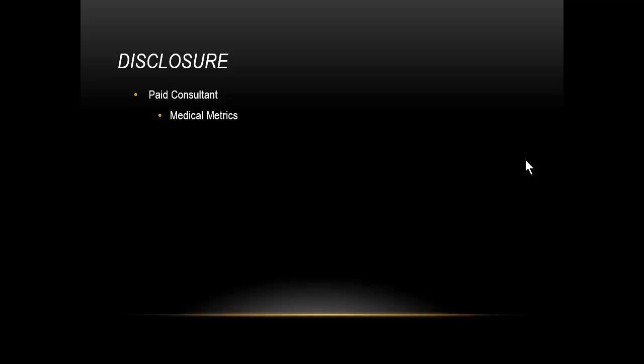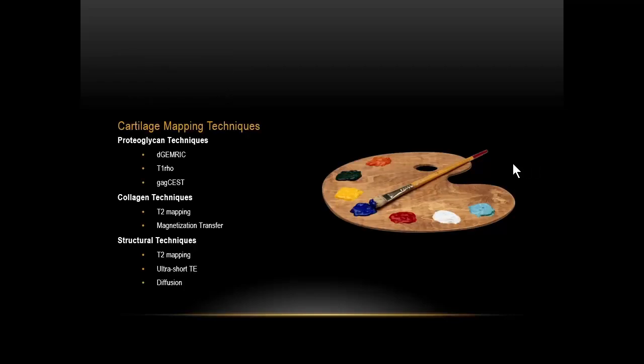I help design a lot of protocols for evaluating cartilage repair and osteoarthritis. We have a large portfolio and palette of different types of techniques that we can use to begin to look at early cartilage damage. Although there is a spectrum of different types of tools that we have, we can cluster them into different categories focused on the different type of application in which they're frequently applied.